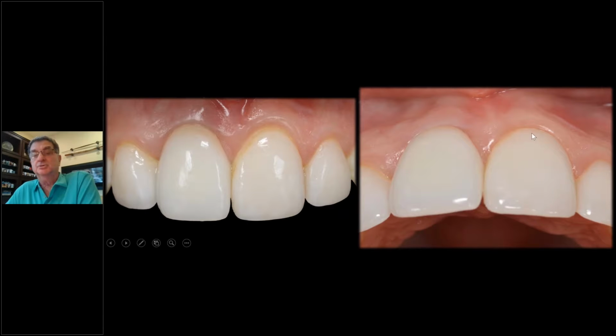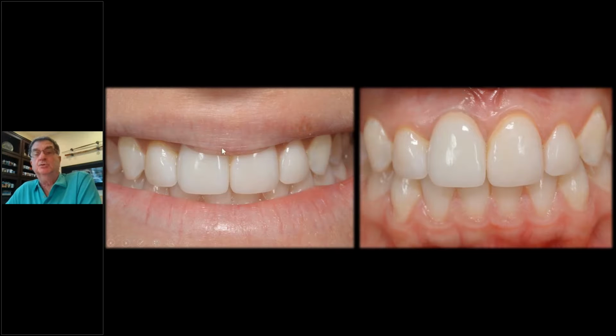And here you see the tissue. We got a nice result. And here you see, she never showed that, but that's more for our head. We got the incisal edges, of course, at the right height. And we got this tissue down just by letting nature under contour the restoration. And she's ecstatic, and she never walked around without a tooth.